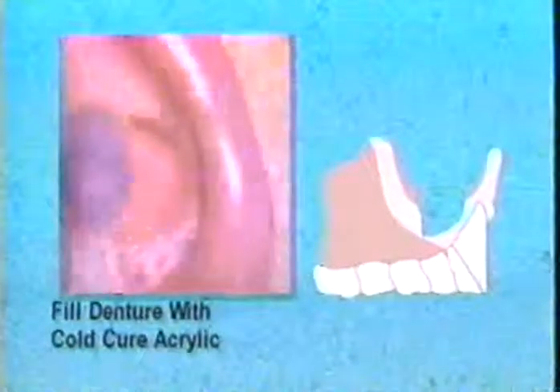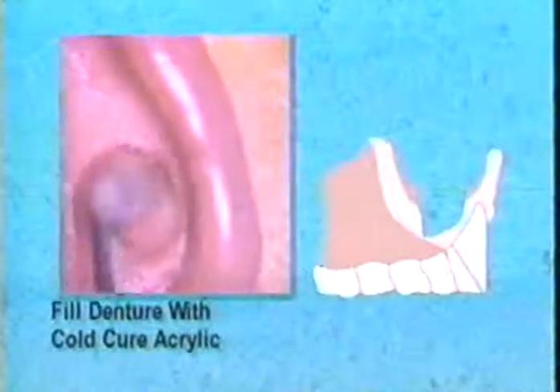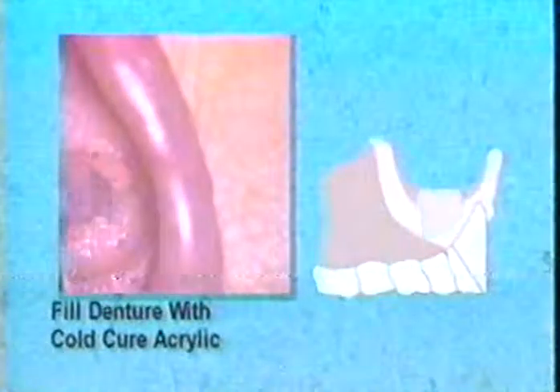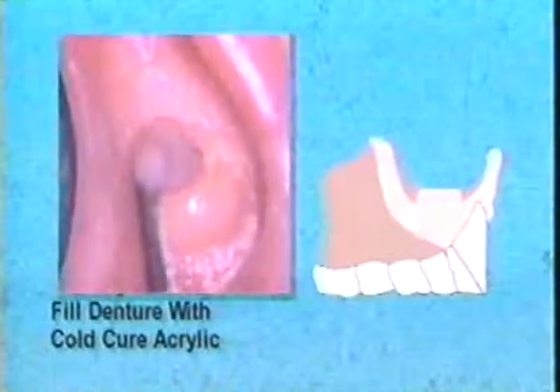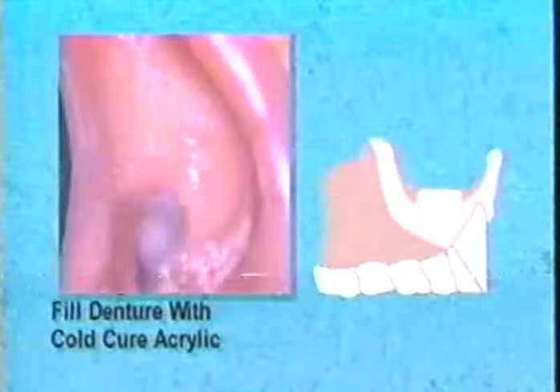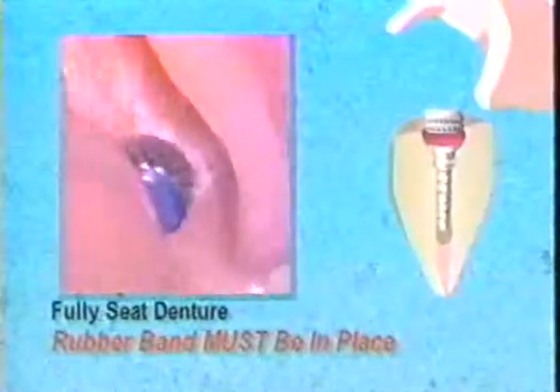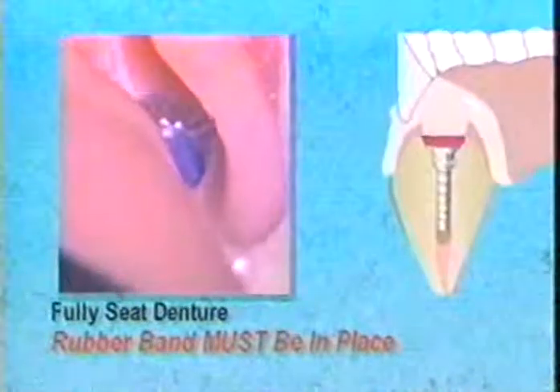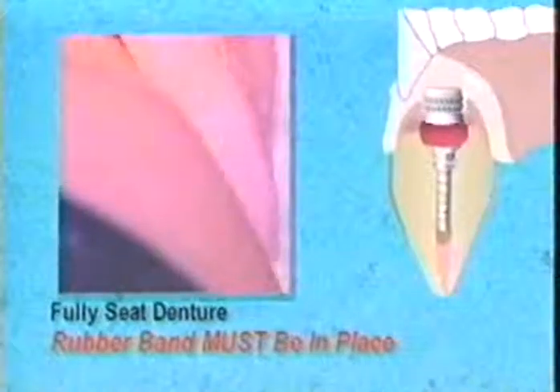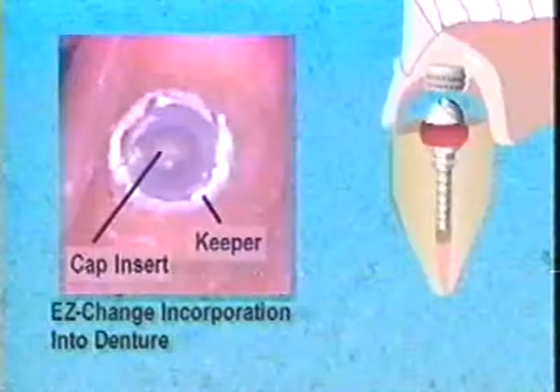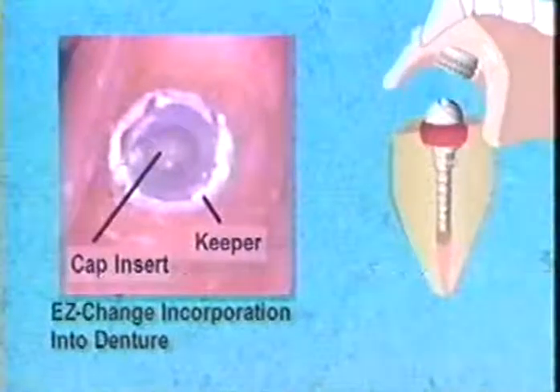Place pink cold-cured acrylic into the relief portion of the denture and place over the ridge and let set. Make sure the rubber band is covering the height of contour of the head; if not, there is a risk that the cold-cured acrylic could lock in under the head, making removal of the denture difficult. The rubber band is now discarded and the flash trimmed. The overdenture is now ready for use.